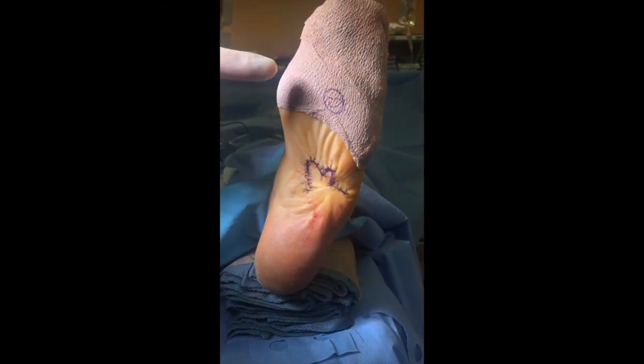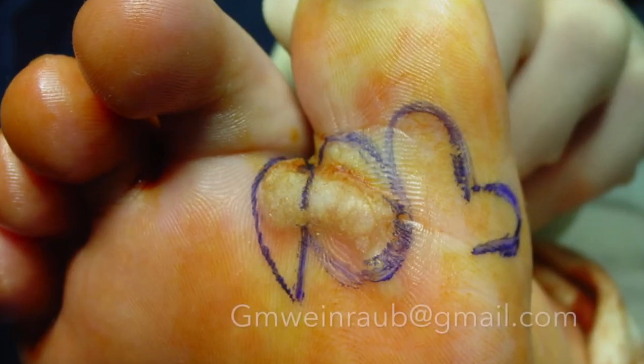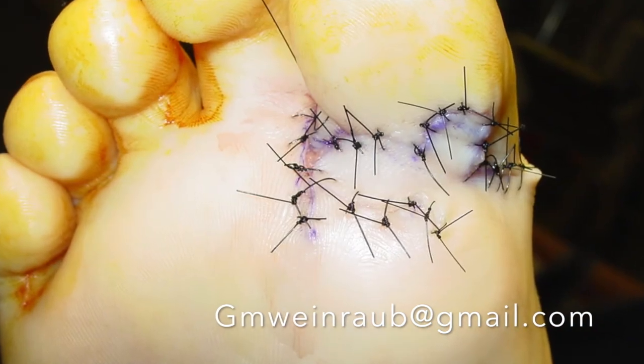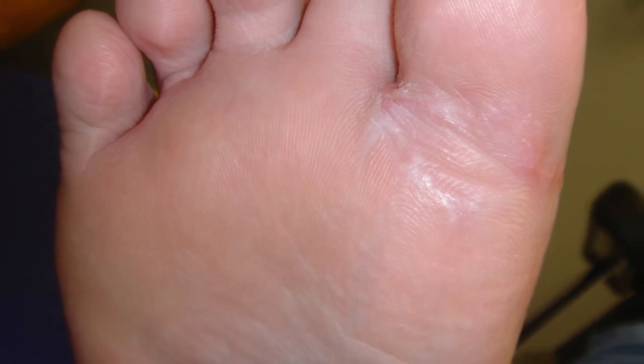We're going to check if this is done — the smiley face says yes, we are done. Just one more example of a bi-lobe flap: this is for a large basaloid lesion, we ellipse out the lesion underneath the web space, then do the bi-lobe, and here is the final follow-up.